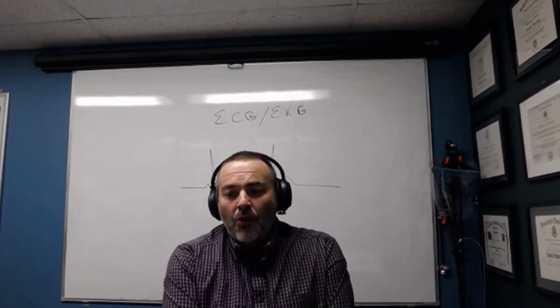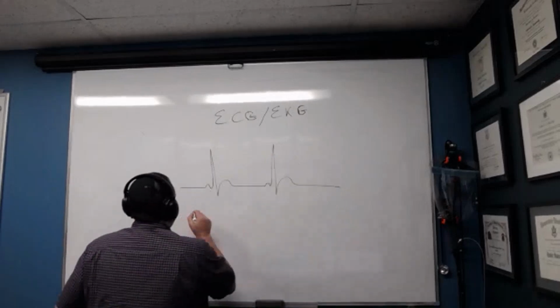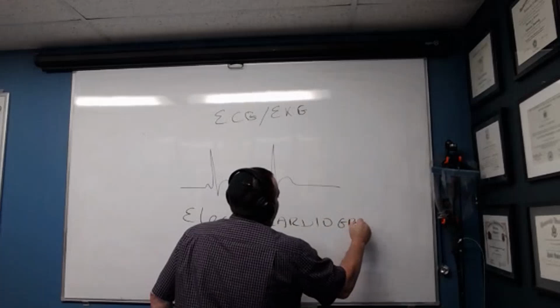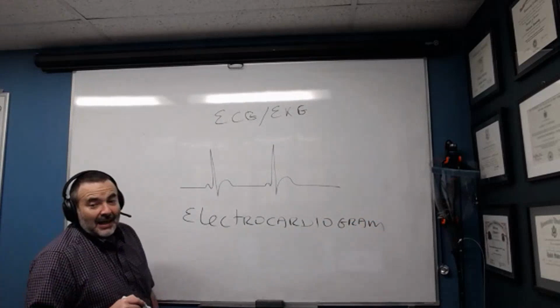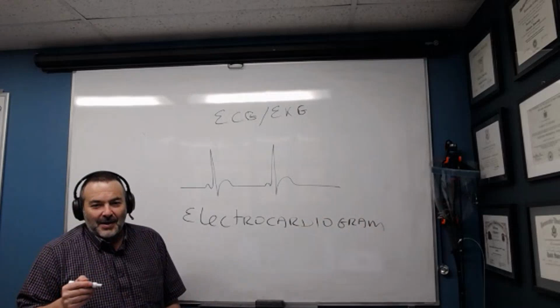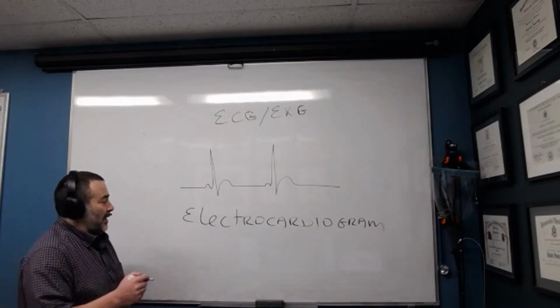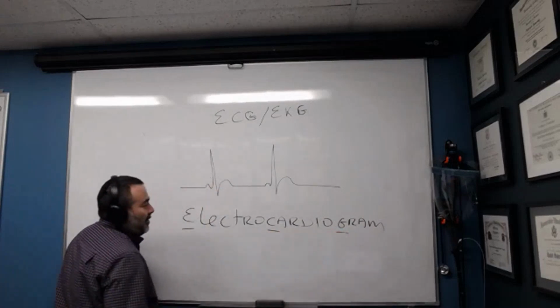It stands for electrocardiogram. People call it EKG and have been calling it for years because electrocardiogram were invented by a Dutch-German scientist, Dr. Eindhoven. At least he's credited with it. And the word cardio in German and in Dutch is spelled with a letter K. Otherwise, electrocardiogram. And here it is.